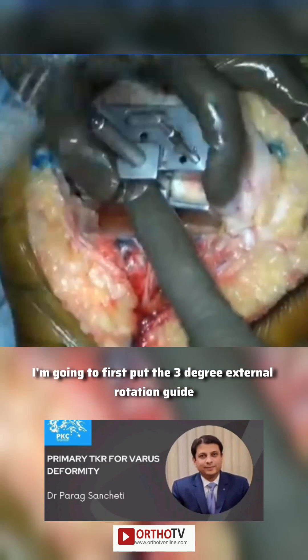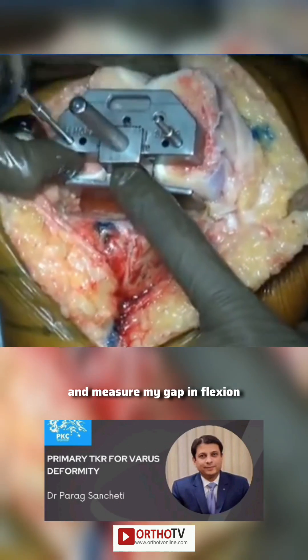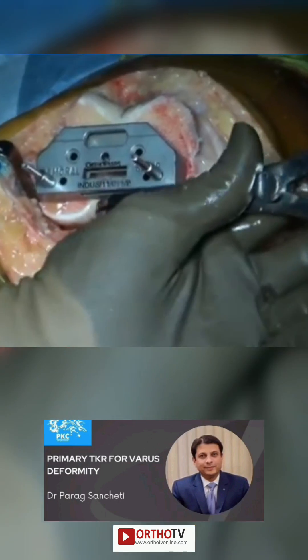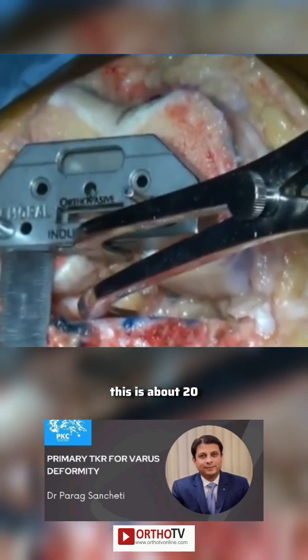Now I just use the Ranawat technique, parallel to the tibial cut. I'm going to first put the three-degree external rotation guide and measure my gap in flexion. So my extension gap is now balanced. Now I'm going to go for the flexion gap.